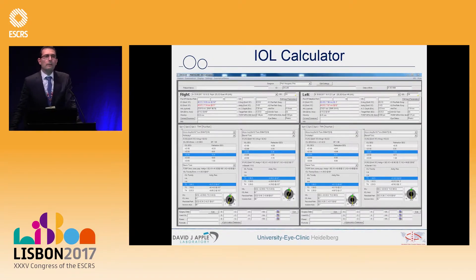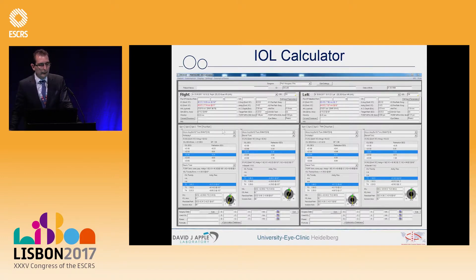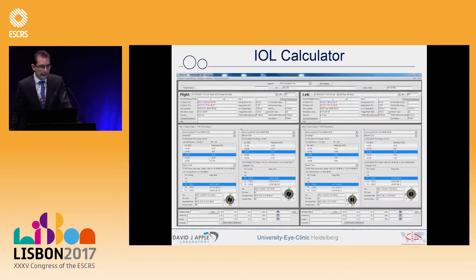When you perform the IOL calculation for the right and left eye, you can read this chart from top to bottom. The real measurements from the right and left eye are placed here — corneal and axial lengths — along with the regular values of surgically induced astigmatism and the target outcome, along with suggestions for a regular eye from different calculation formulas: Holladay, Barrett Toric, Savini Toric, and Barrett — and the same for the left eye.